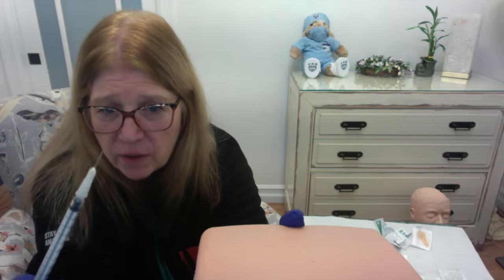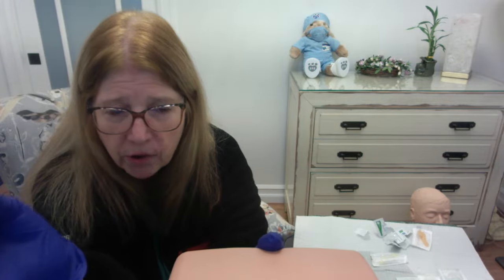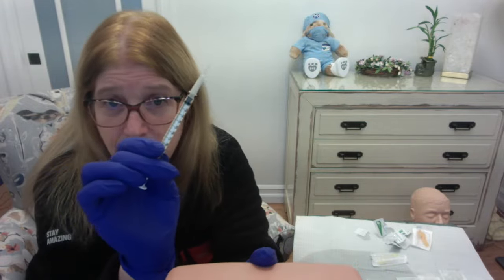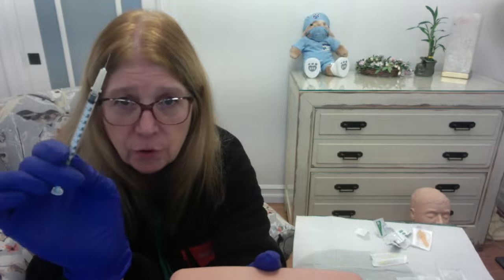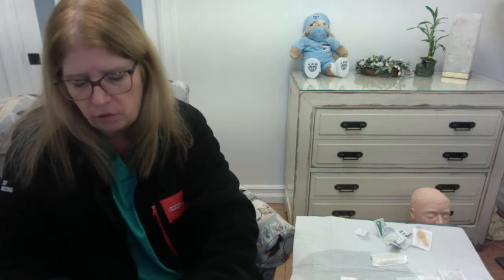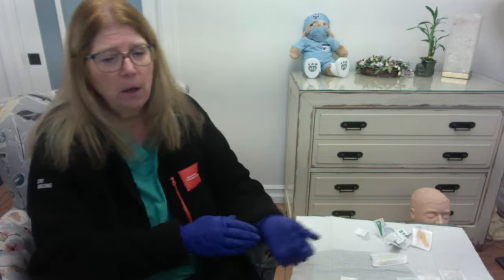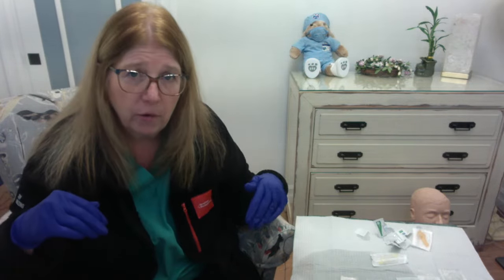There is no safety device on this needle and syringe, so this is going to go straight to the sharps container. I am not attempting to recap this. I'm not even attempting to recap it safely. No recapping at all after you have injected. Okay, so that's our intradermal injection. Now let's move on to subcutaneous injection. One more thing on the intradermal. So where can you give intradermal? You can use the forearm, you can use the upper scapula, even the upper outer buttocks, okay?